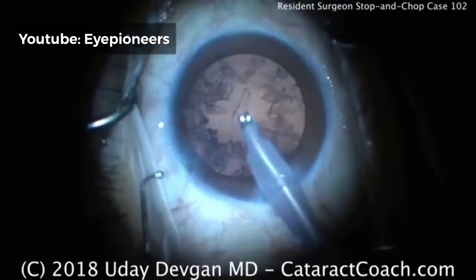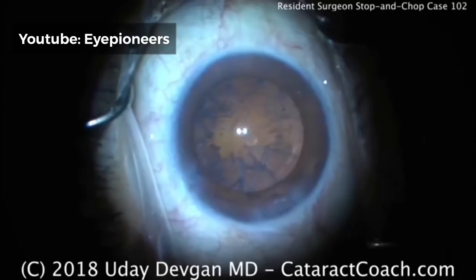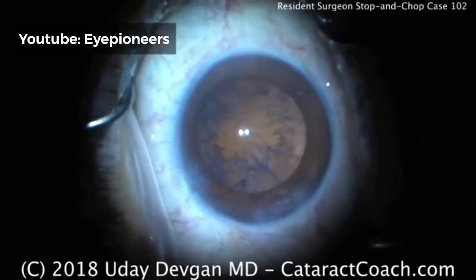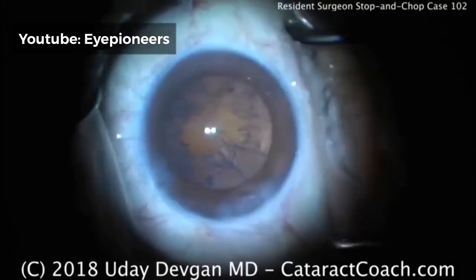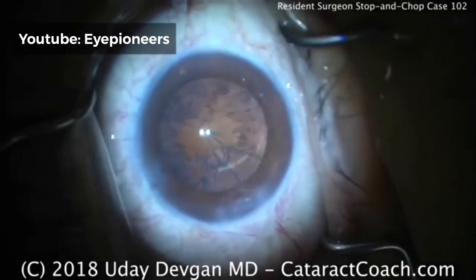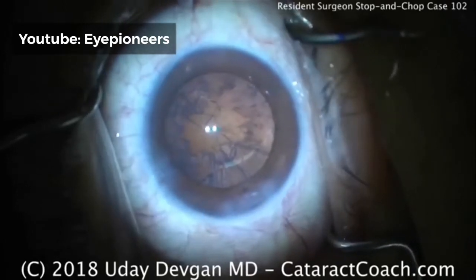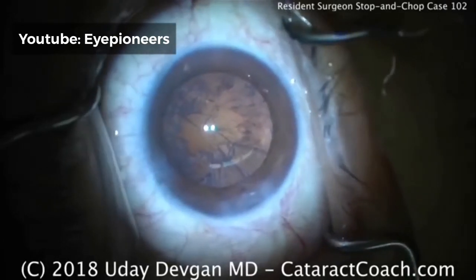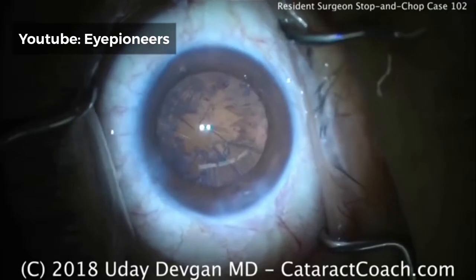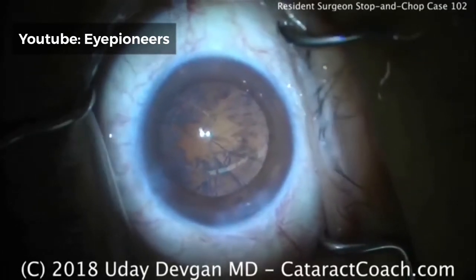Coming out of the eye — time for irrigation aspiration. Very well done. Placement of the incisions I like; they're a little bit shy of 90 degrees away — maybe about 70 to 75 degrees between incisions. Anything between one to three clock hours away is typical. I tend to prefer about two clock hours away, or 60 degrees between the side port and the main incision.